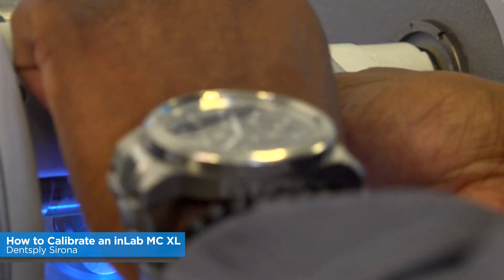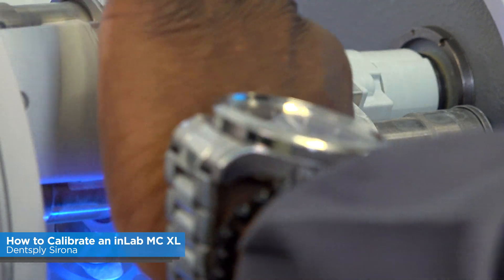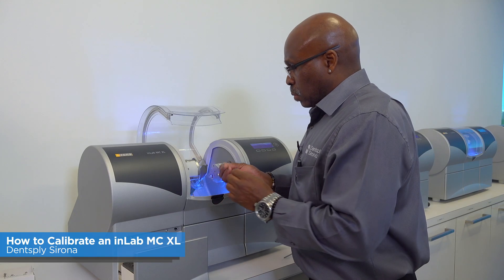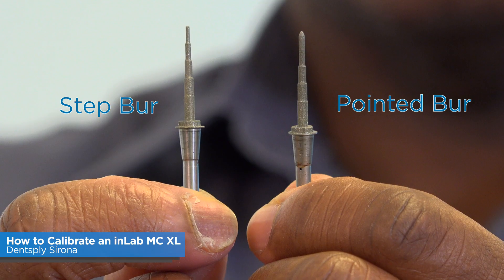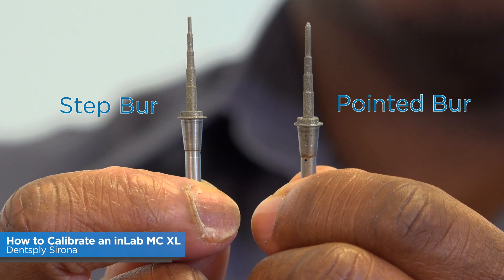Remove the calibration pins and put in the 20 millimeter burs. On the left is always going to be the step burr, and on the right is always going to be the pointed burr.